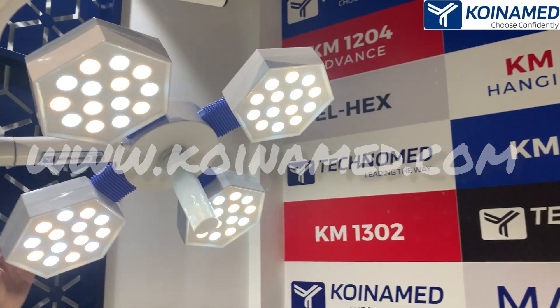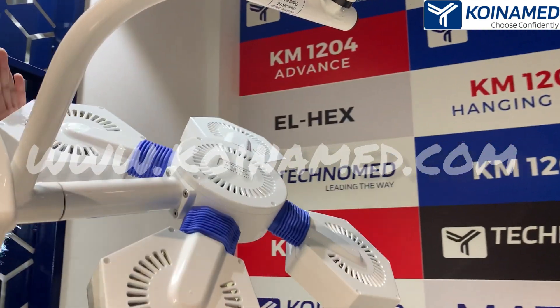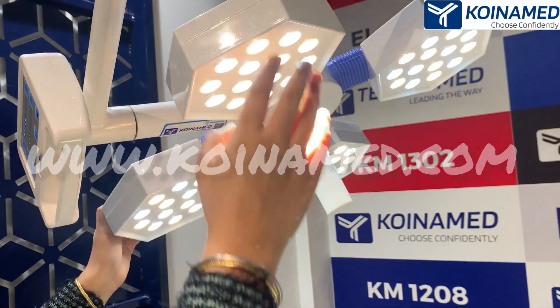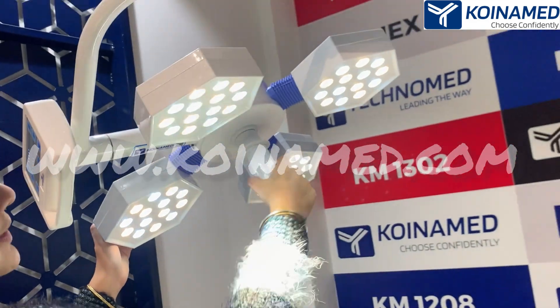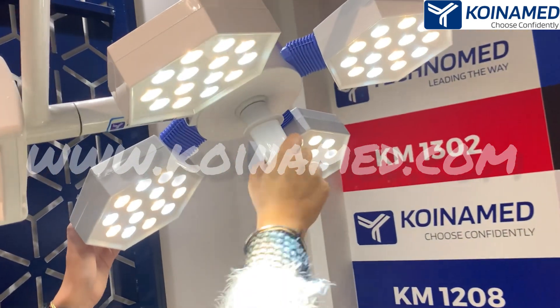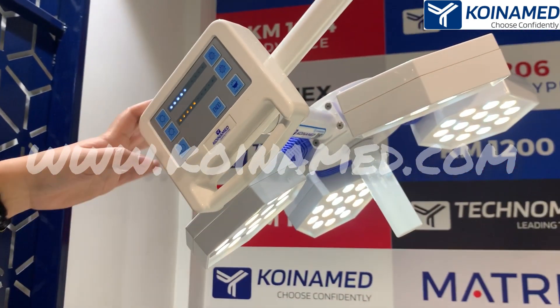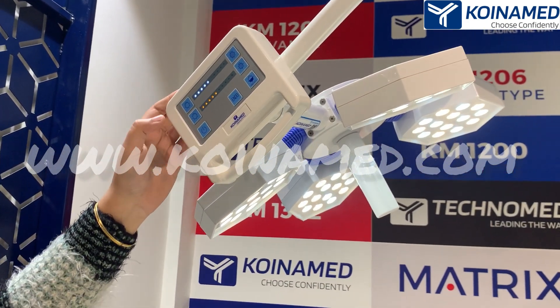On the back side of this dome you will see the European design for the heat ventilation. Here in the middle we have provided the sterilizable handle for adjusting the focus. Now let me show you the capacitive touch controller — you will also get the same features here.